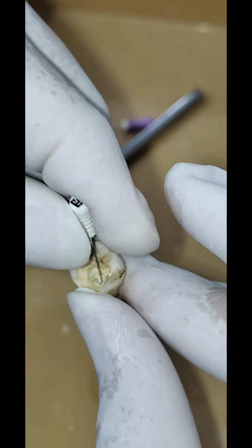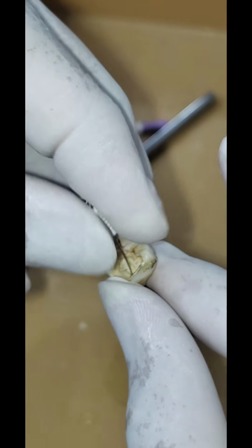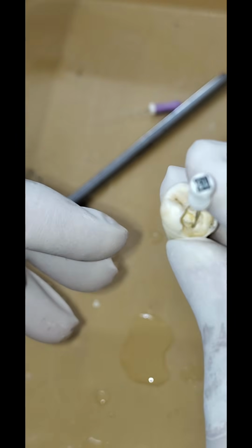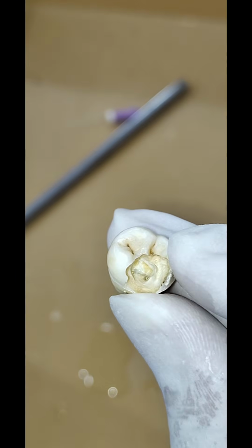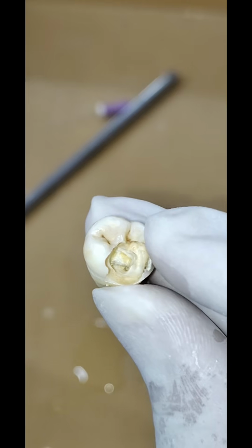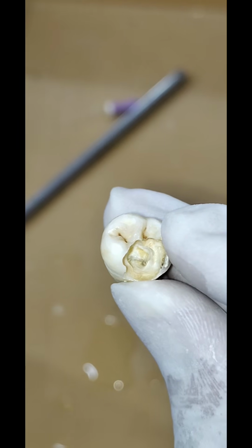So now we place it in the distal. Distal seems better compared to the mesial, but as far as the access cavity is concerned, the access cavity is complete and it's only containing two canals with no presence of a third canal, and dentinal maps confirm that.